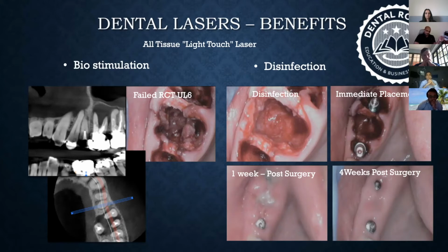Previous to what I used to do with dental lasers, the protocol for me would have been I would scoop out as much as I could possibly scoop out, clean it and disinfect it as much as I can disinfect it. I don't think I would have had a heart to do anything other than that. I would have closed it down and then sent the patient off home for the next 3 to 4 months time. Get the patient back after 4 months, take a scan, see if it needs a sinus lift or any kind of a bone augmentation, place implants, send them home, and then maybe 4 or 5 months later, restore it. So, on the whole, the patient would have had 4 visits, a year probably by the time I would have finished the whole treatment. And I'm pretty sure that the healing process wouldn't have been the nicest for the patient as well.